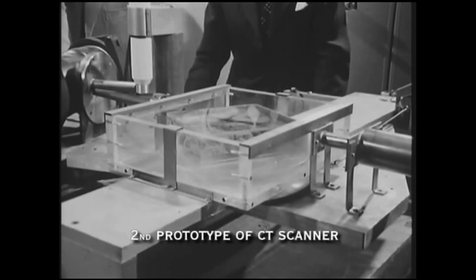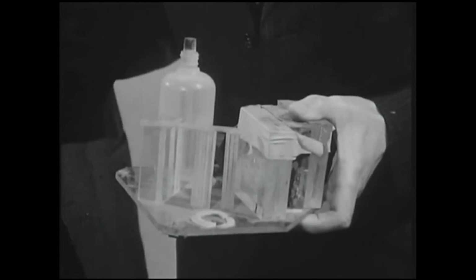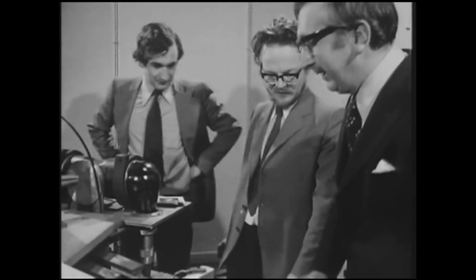Tests begin on a rig built from an old lathe. X-ray data is fed into a computer. Would it show up density differences in animal tissues as well as it does on the Perspex model? Hounsfield searches for specimens where he can find them.